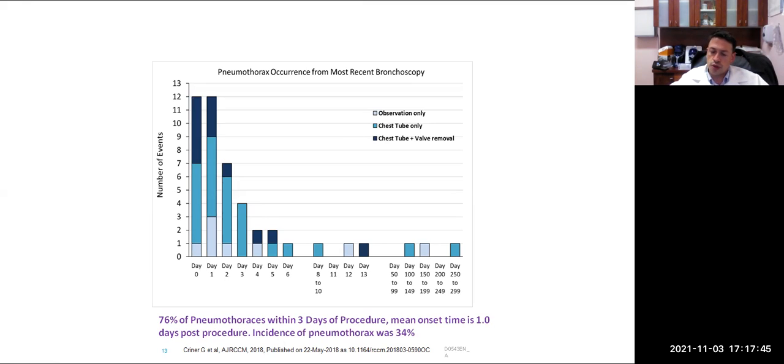So a pneumothorax is thought to develop from a hyperexpansion of an adjacent lobe, which is actually a sign that the procedure is working, right? I mean, you cannot get a pneumothorax if you didn't have any lung volume reduction. So some of our success patients are the ones who develop pneumothorax during their initial couple of days of the procedure.